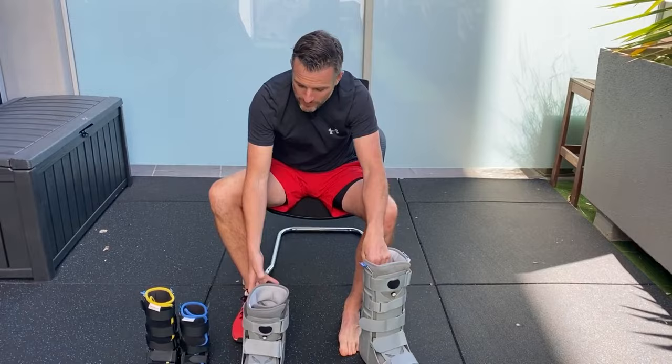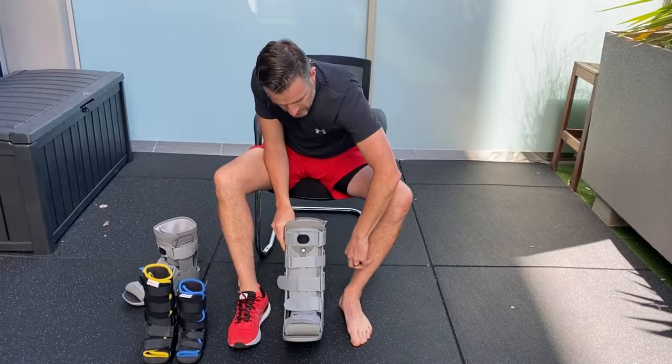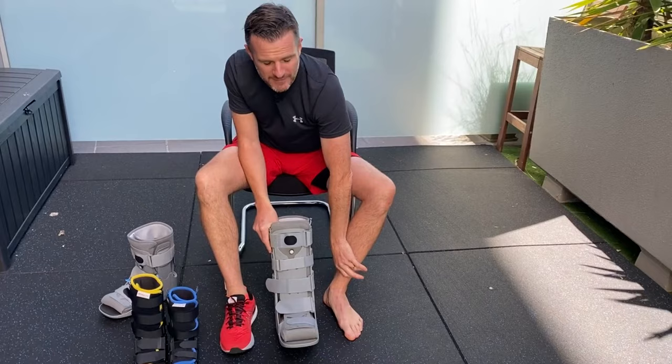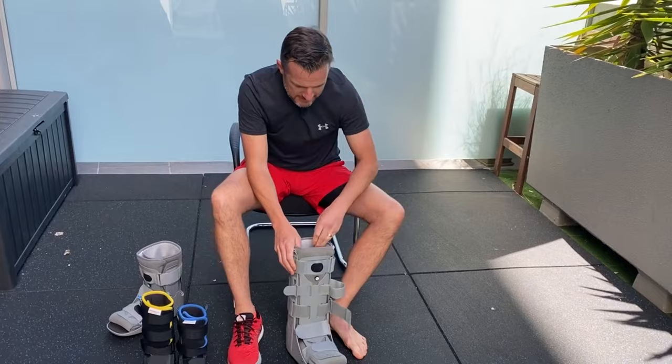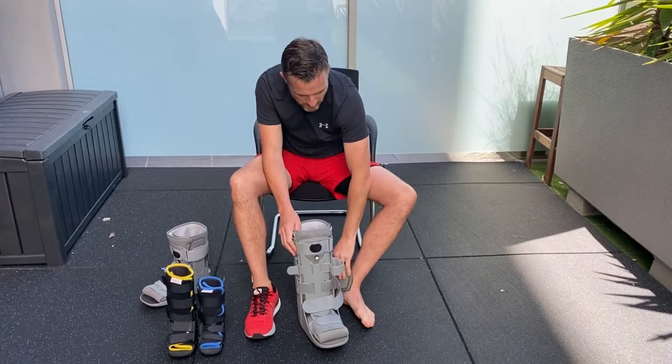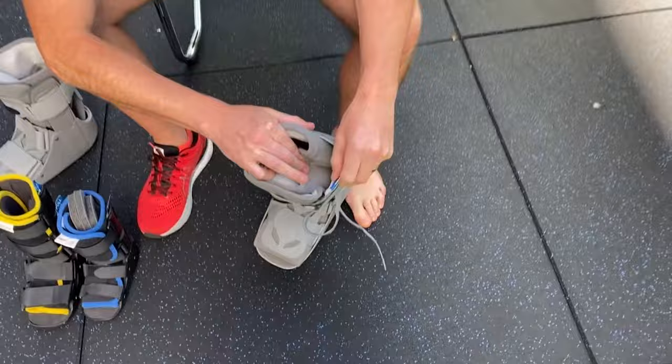Let's focus on how to put the tall boot on. You'd normally be in bare feet — if you have a sock on, you'll get a compression line around your ankle. The boot washes out inside. When they come, they come with three little pads for people with sensitivity around the ankle or skinny ankles that don't fill out the boot.